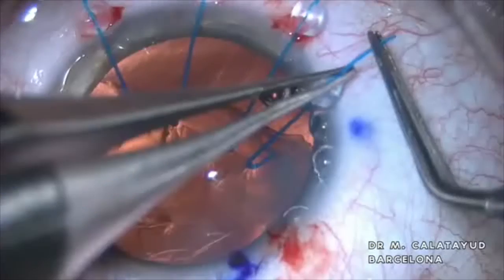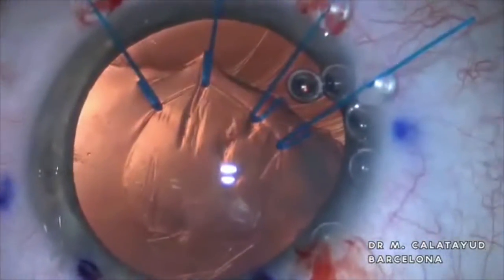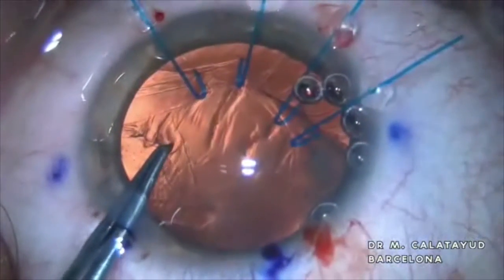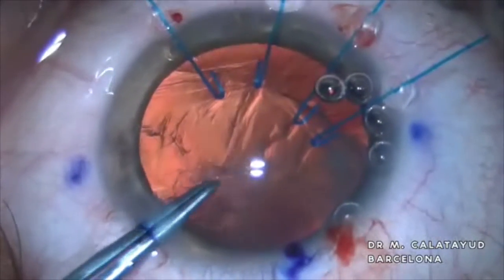Once the back is fixed, at least in this area of subluxation, we can continue with our capsulorhexis with the forceps, always pulling to the center of the crystalline.